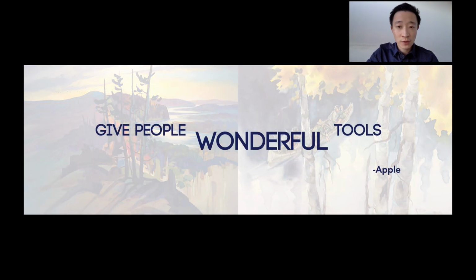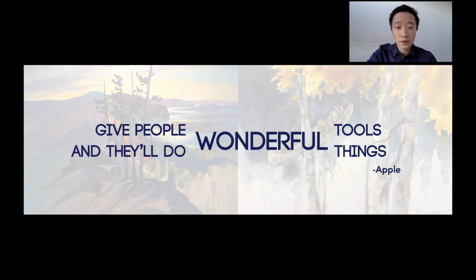I'll begin with a quote that has a theme for this topic: give people wonderful tools and they'll do wonderful things. I think that we are blessed to have a company like Megagen that never stops innovating to give us great tools like some of the ones I'm going to mention today.